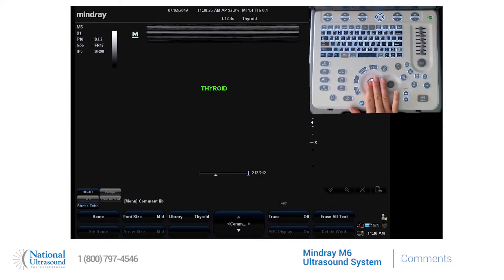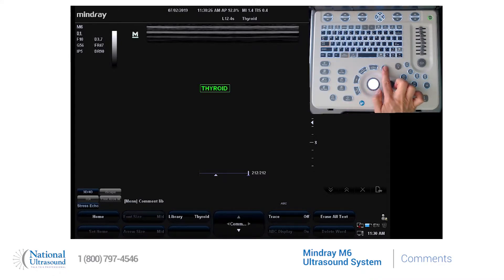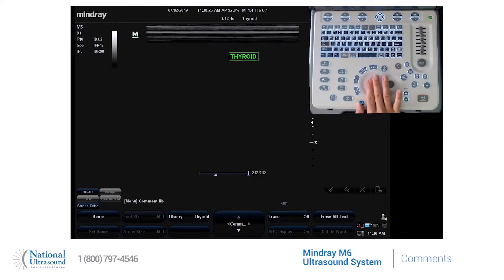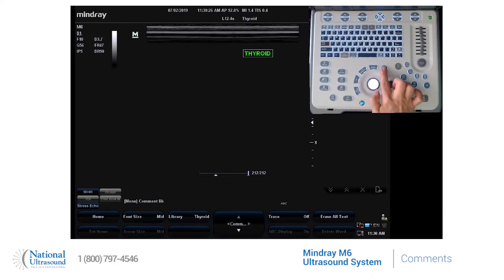If you want to move the word, hover your trackball over the word, press the set button and move the word wherever you like, and press set to anchor.